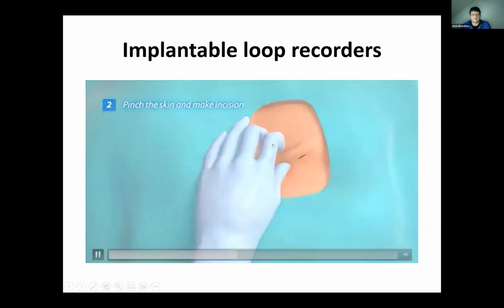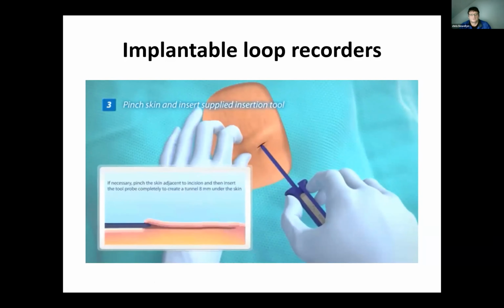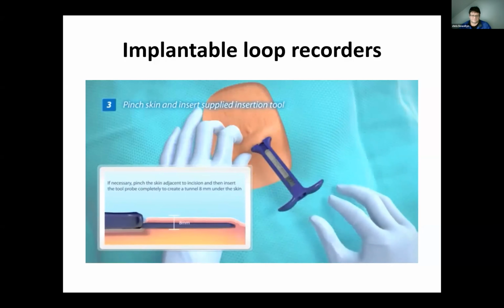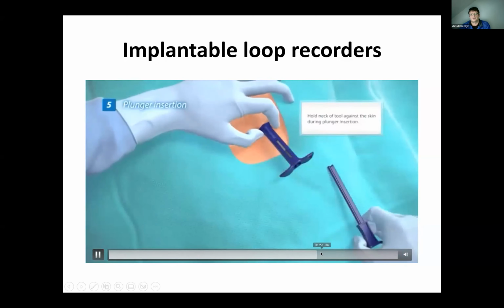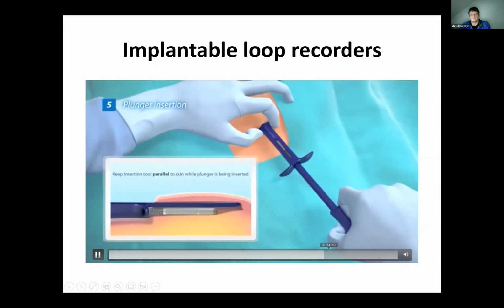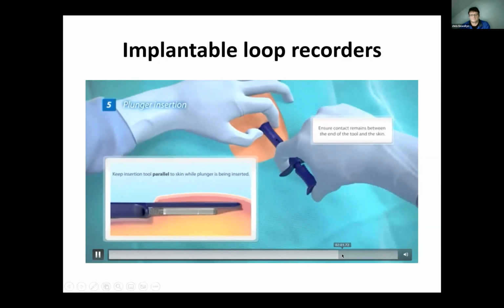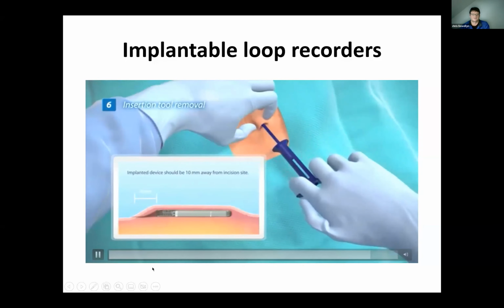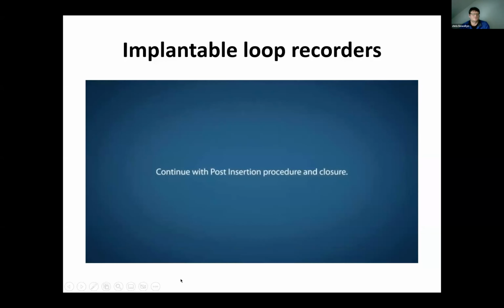Well, I have to say, I don't particularly like this implantation tool. We use a scalpel ourselves. And the devices are all relatively easy to implant. Dilate underneath the skin, put the device in. I'm going to skip this forward a little bit. Turn the device around and pop the device underneath the skin, leaving the device behind. And then most of these are just closed up with steri strips. Occasionally use a little bit of a stitch. This will just go on for a few days. Relatively straightforward.